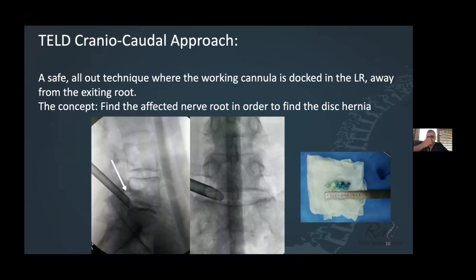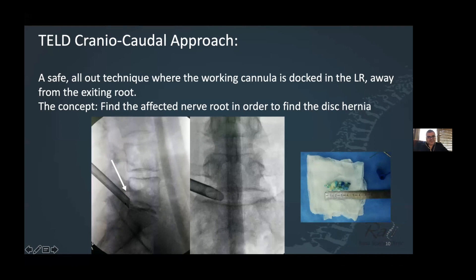Moving to the craniocaudal approach — it's a safe, all-out technique. The idea is simply to dock your working cannula in the lateral recess. You stay out of the disc at all times and address the pathology where it is. The concept is straightforward: you don't focus on the disc fragment, you focus on the compressed nerve root. If this is a traversing nerve root problem, you push your cannula immediately into the canal while remaining all-out in the canal to take the herniated fragment pressing on that S1 traversing nerve root.